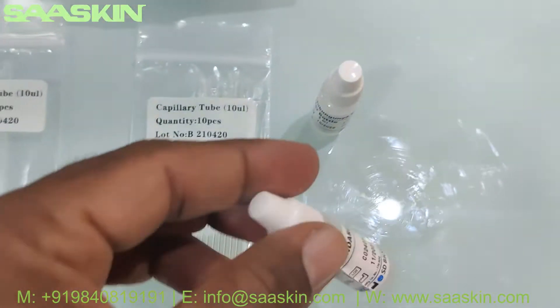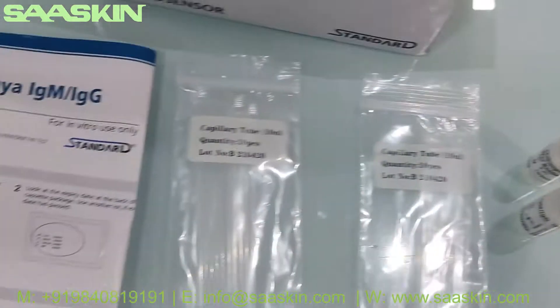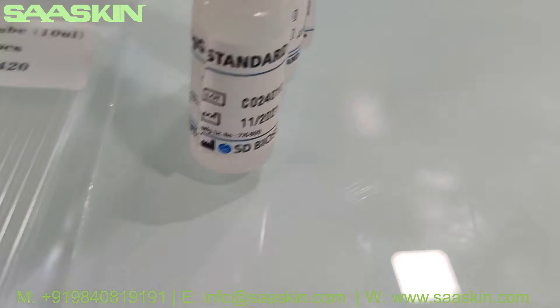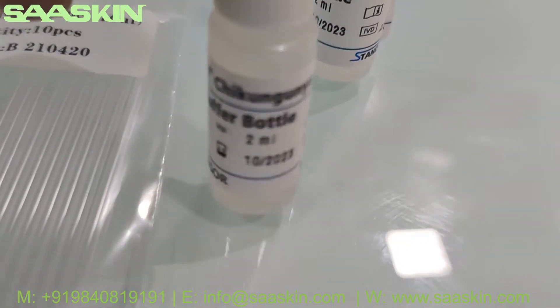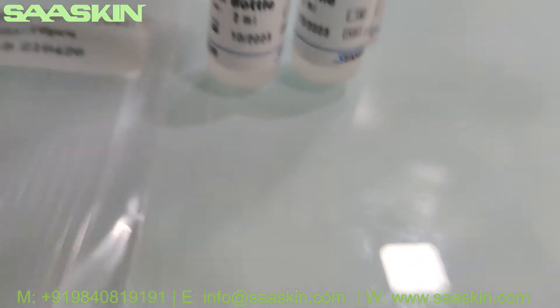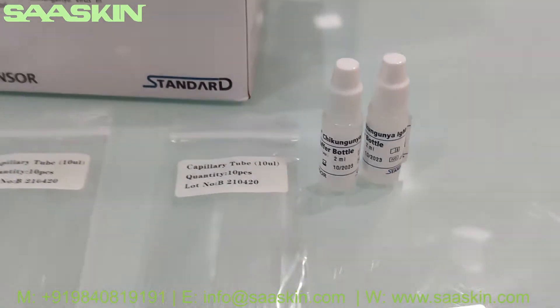And here, inside, you have two buffer bottles. The box says one buffer bottle, but they actually provide you two. These are 2 ml buffer bottles.